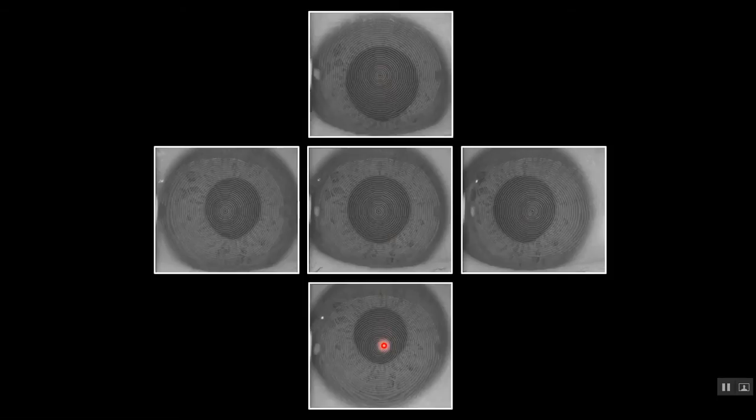It may only be one ring if the angle kappa or angle lambda is low. However, if you can't push the rings to the peripheral cornea, then have the patient fixate another ring. So rather than one ring, go 2 rings. If that doesn't push it down to the bottom or the extremity, then go for 3 or 4 rings.